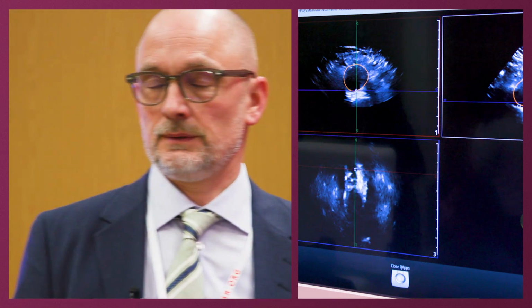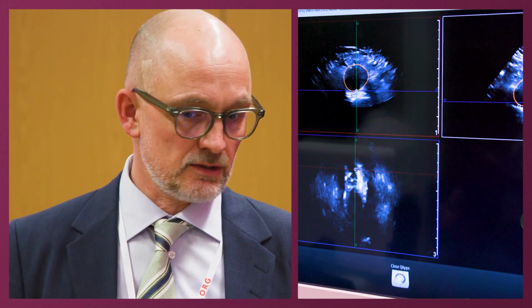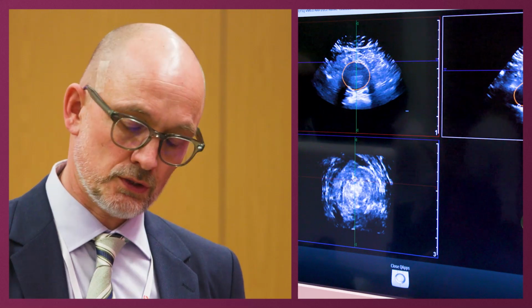From a pragmatic point of view, it's only the maximum diameter because that is correlated to rupture risk. I know that we are at the moment discussing if the thrombus thickness might be an additional risk factor, but it's not part of any guidelines. So I thought it would already be tested at some point. No, because we never do. We are not interested in the thrombus. You can always get your EVAR device up, and you can for sure always operate them open, thrombus or not. The device either goes through the thrombus, you just push it through.